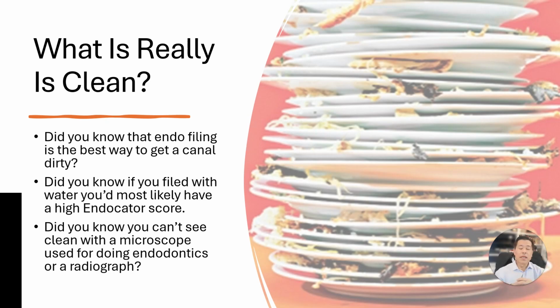When we do a root canal, we can follow our protocol. It could be a certain file system, a certain sequence we go through, a certain irrigation sequence that kind of matches our mechanical cleaning of the canals. But we really don't know when or how clean those canals really are. Are they clean enough that we've removed enough of the bioburden, the tissue, the bacteria, and everything else that's in that canal? Have we removed that till it's spot clean? So when we seal that up, we know there's not going to be any bacteria that can cause another infection or maybe not allow the current infection to heal up.